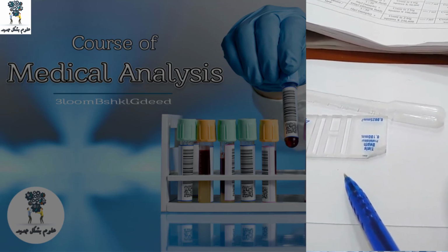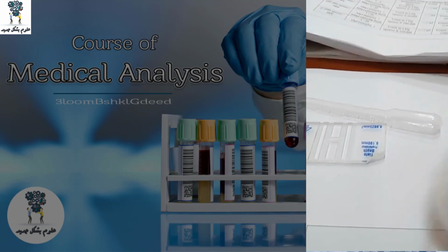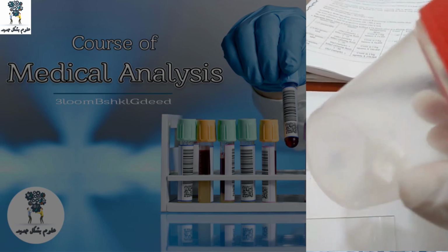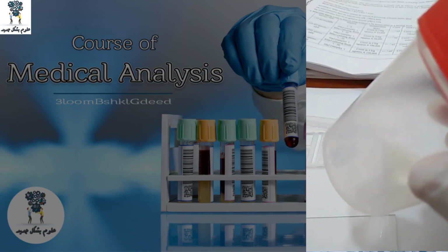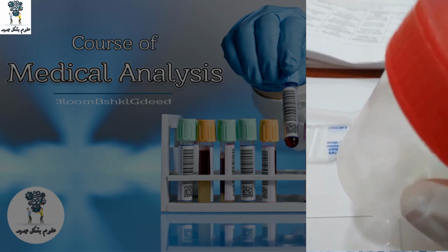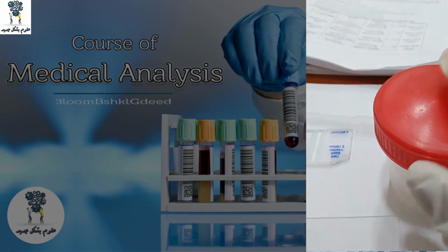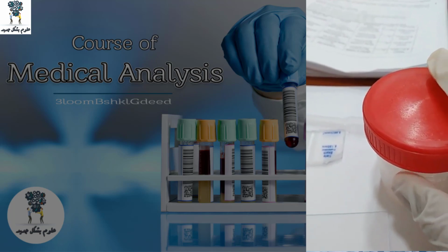If there are no sperm here, we will make centrifugation for the whole sample, as it is our responsibility to confirm before writing that there are no sperm. So we'll put it in a special centrifuge tube and centrifuge for 15 minutes at 3000 RPM.